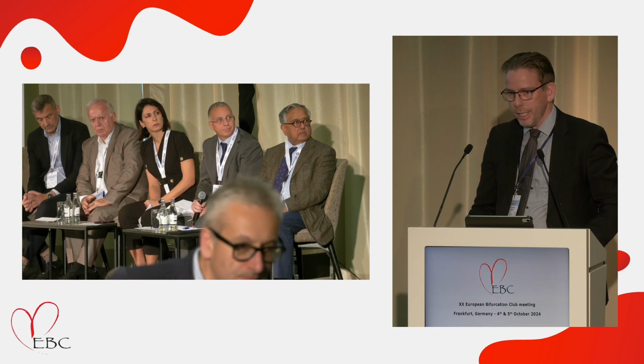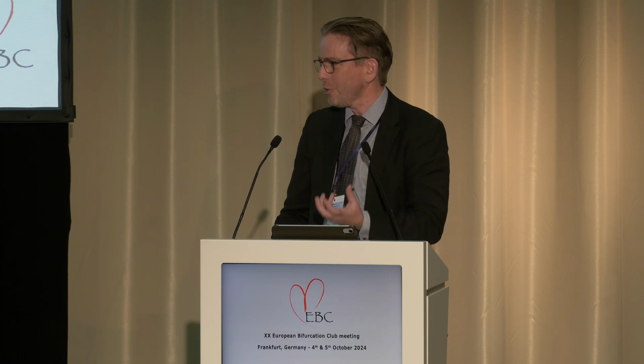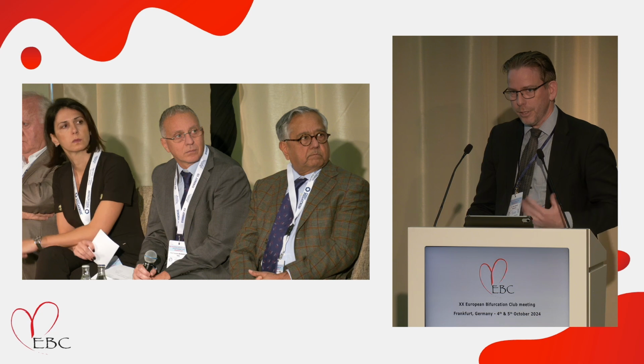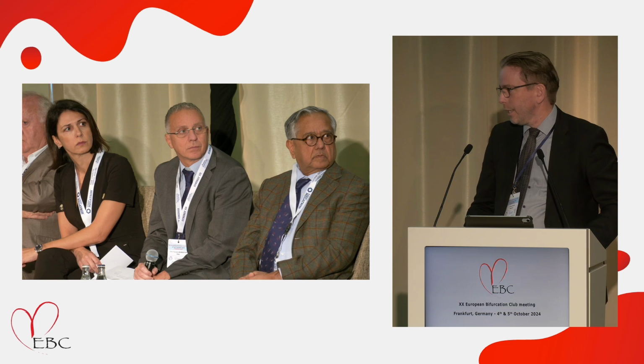To the first question, yes, the only procedural death we had in the OCT arm was a severe stent deformation in a left main case, a two-stent technique where certainly steps were not done in a correct way, and suddenly it was a crushed stent in the left main, and the patient thrombosed and died during that procedure. And then there were all the other cases that died during follow-up, yes.